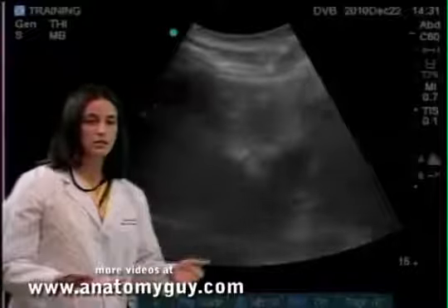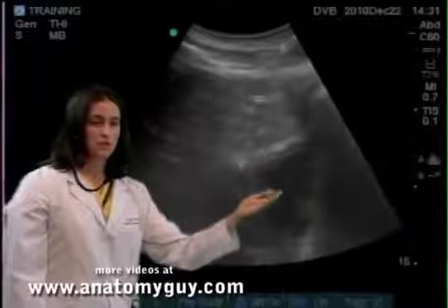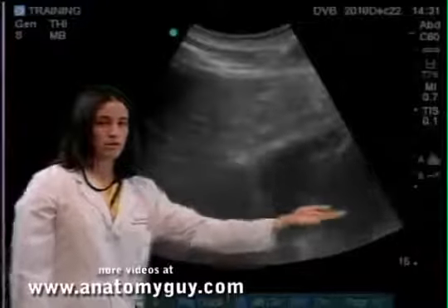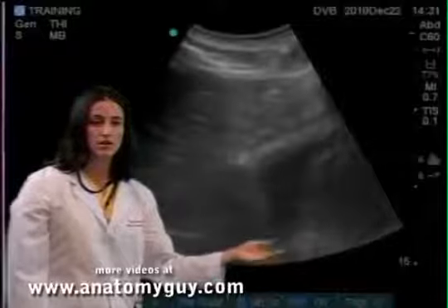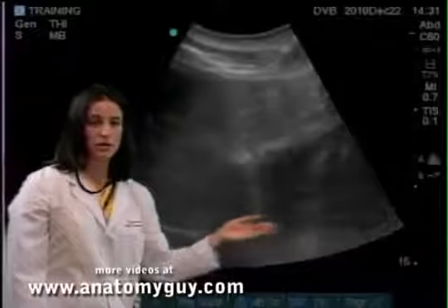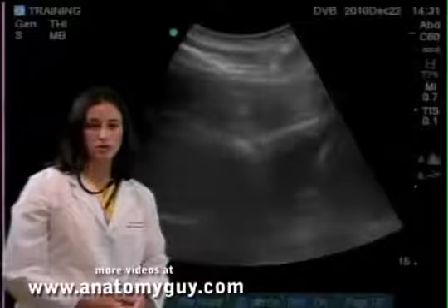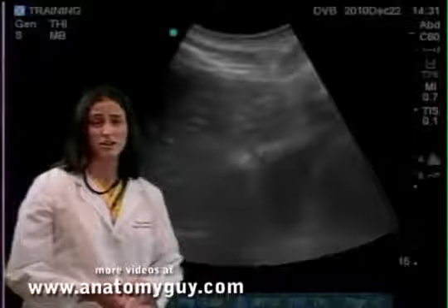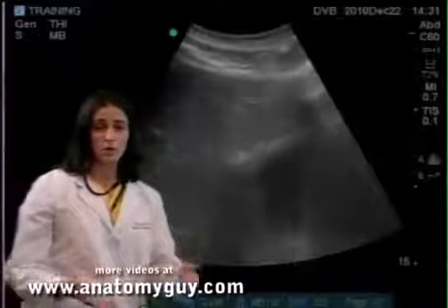To point out the clinical anatomy that we see here, we are using the liver as an acoustic window. We see, and first come to the right ventricle, the left ventricle, and the septum. This is a normal beating heart that is not hyperdynamic. There is no hypoechoic stripe or black line indicating a pericardial effusion. This is unlikely cardiogenic shock. The patient is not tachycardic here, and there is nothing indicating a pericardial effusion.